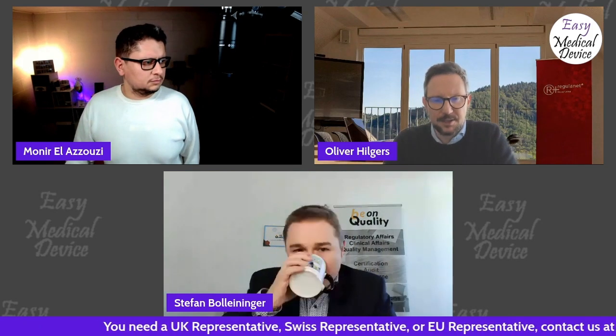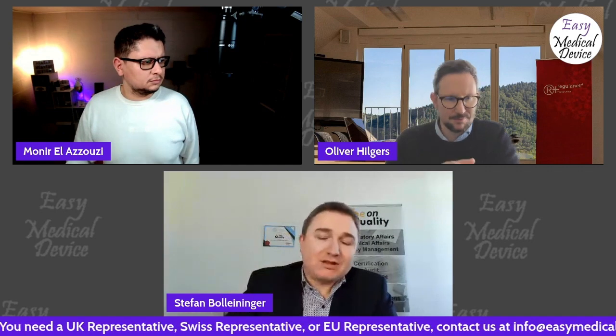Yeah, agree. I think it's similar to the IVD transformation. Under MDD, you had a lot of IVDs similar to Class 1, and now you have this big shift to the IVDR, and for software it was the same. Under the MDD, a lot of software was under Class 1, and now theoretically you have a big change.